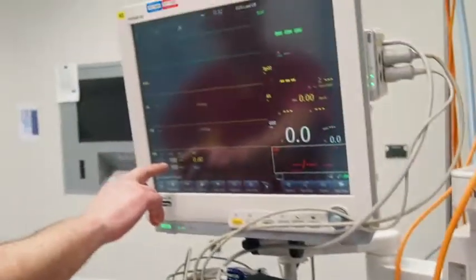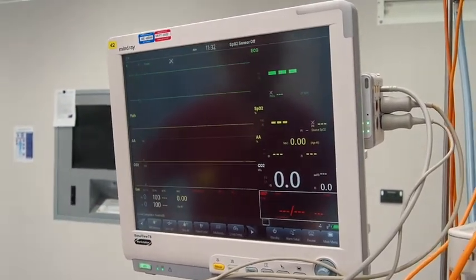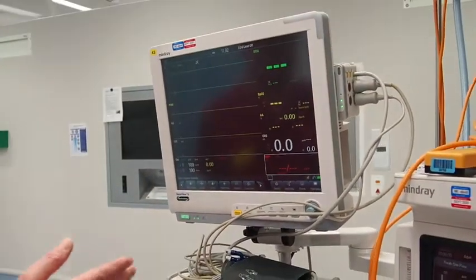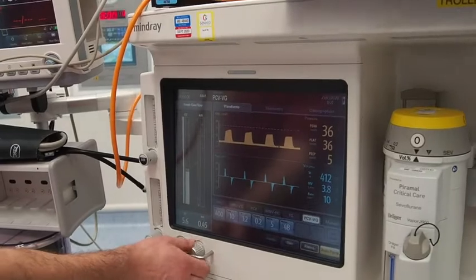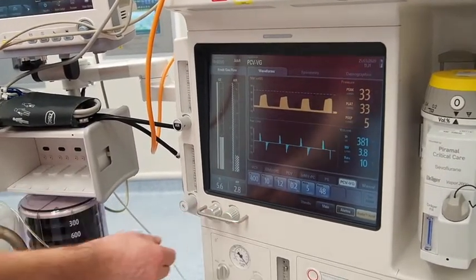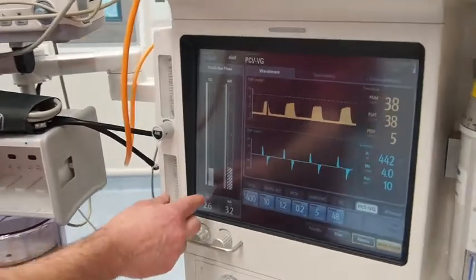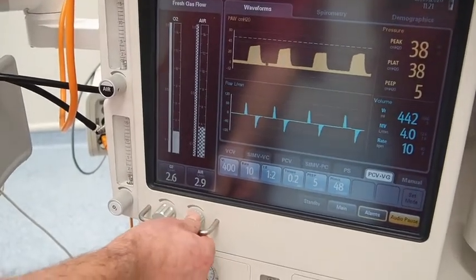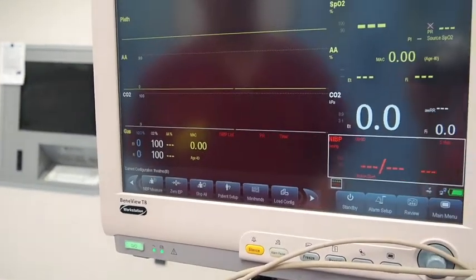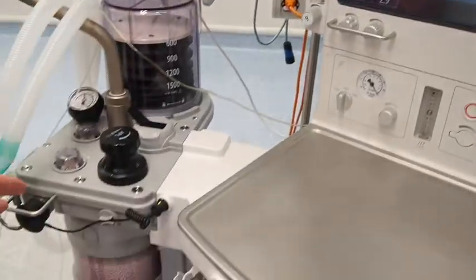The oxygen the patient is getting will be on the display here because it's picked up on the CO2 line. If you want to give less oxygen, what you have to do is start adding in air. And it's a bit of suck it and see really. So say if you want to give 50%, you might go down to 40% oxygen here and 60% air, and that might work out about 50%. And you just have to tweak these dials to get the number that you want. And there's a lag in the system because the system's got lots of capacitance.